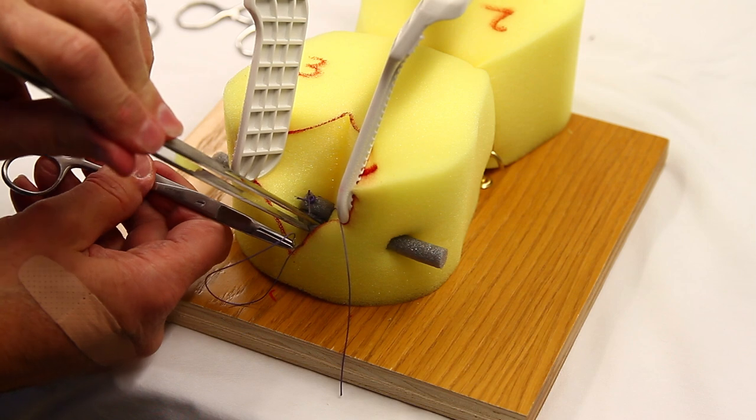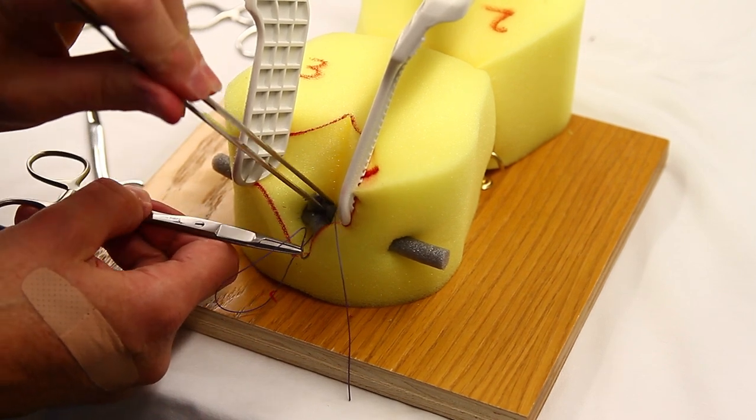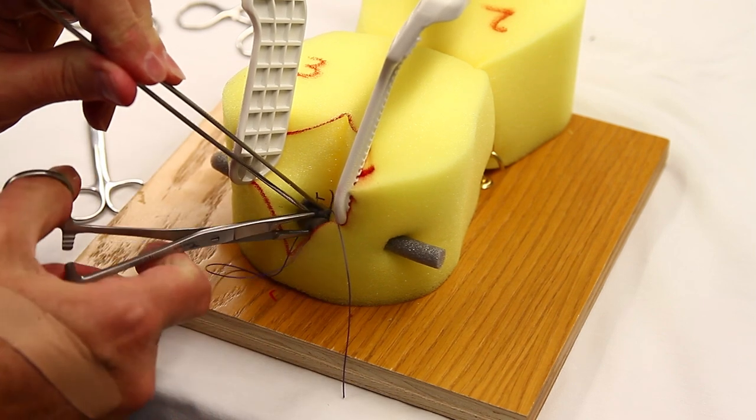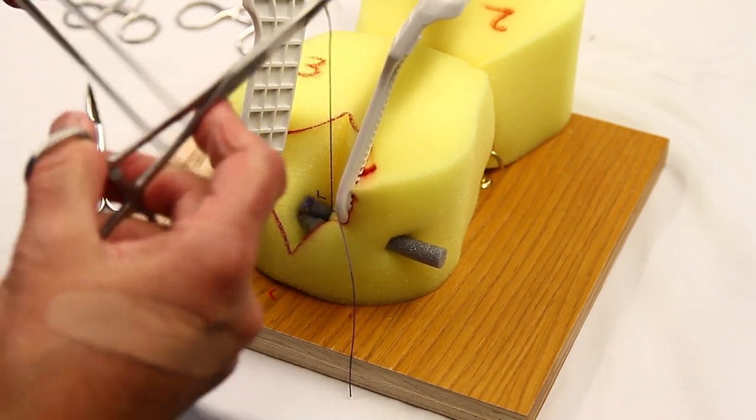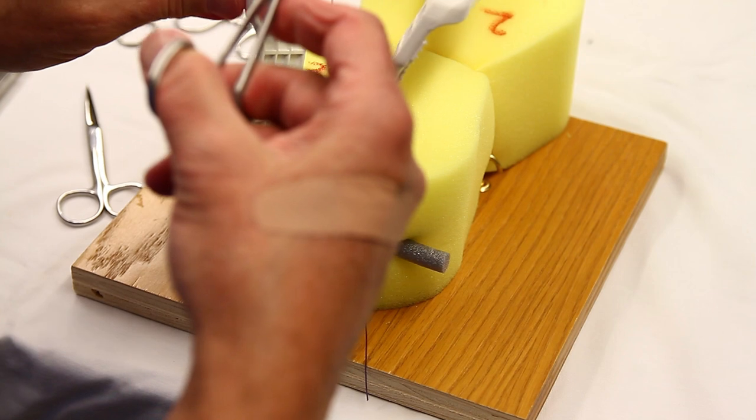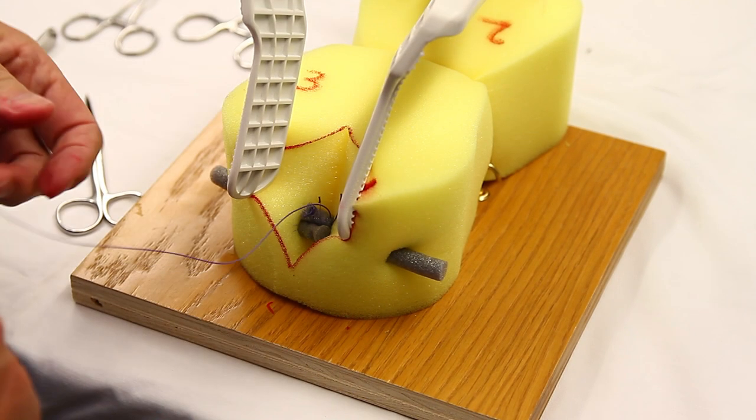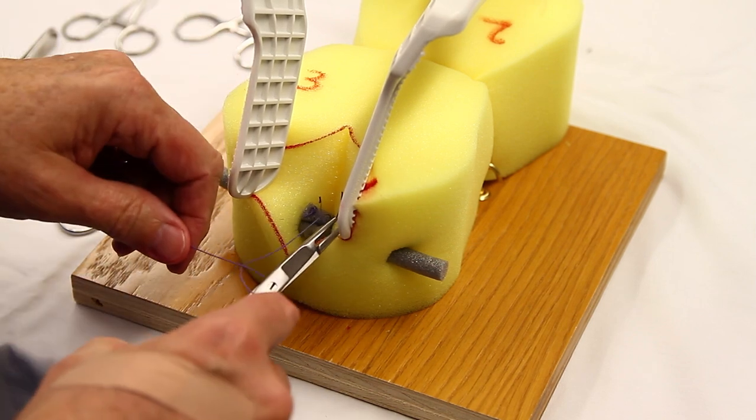If you don't have those services in your labor delivery area, a trip to the operating room is very worthwhile. You've got to see and you've got to have help. So that's through and through again. This is the second one. We'll shorten it up a bit and then we'll tie it.